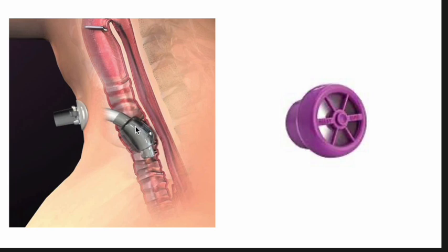Do you think this balloon should be inflated or deflated? So in a patient who is not hooked up to a mechanical ventilation, who's breathing spontaneously, you want this to be deflated, because otherwise that air is just going to be going in and out of this tube if it's inflated. It takes a lot of pressure to push the air through such a small airway. Imagine breathing through a straw. So in someone who is not attached to the ventilator, you want this to be deflated.